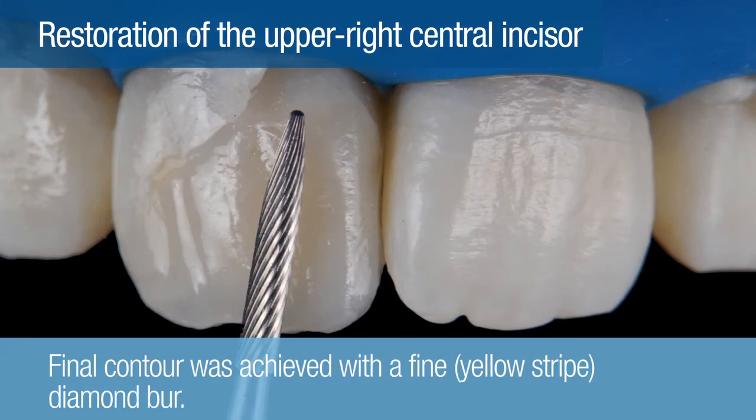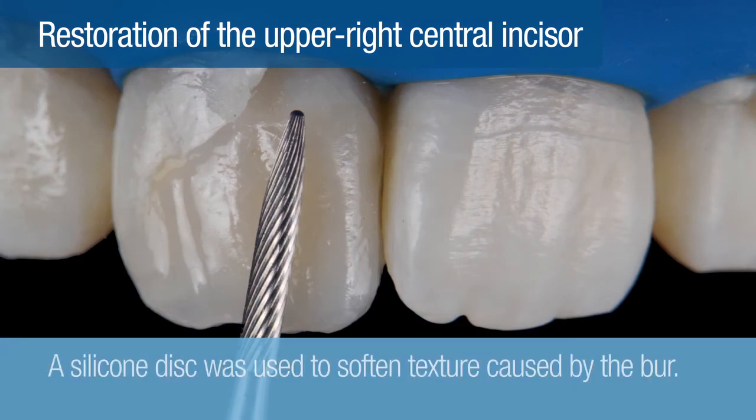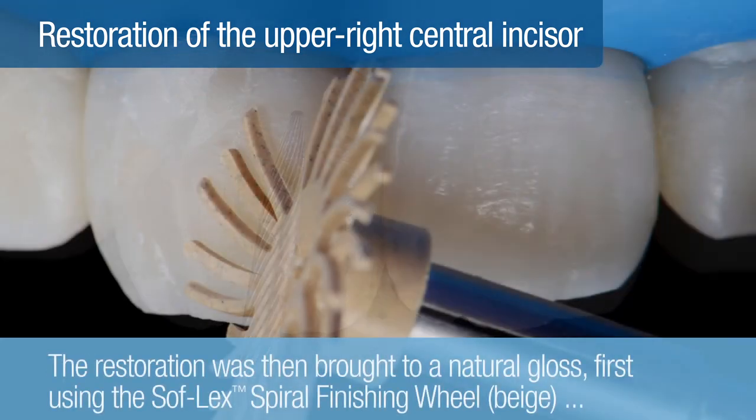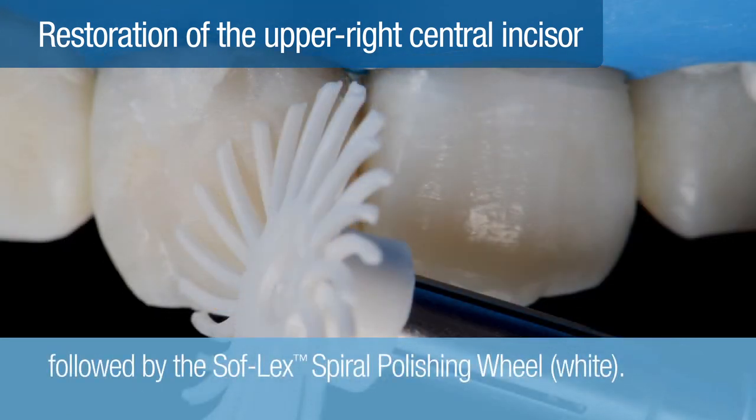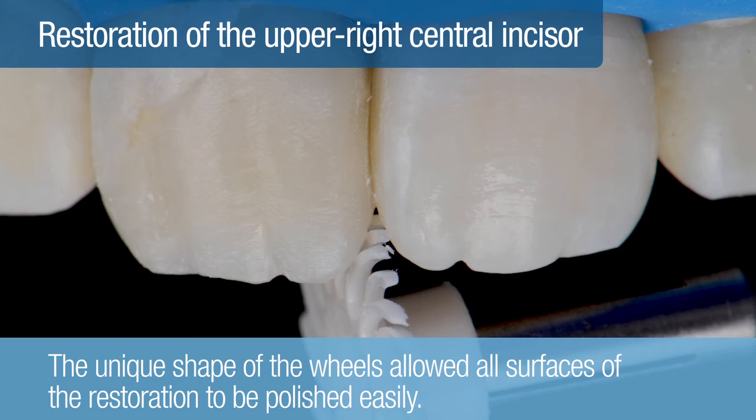Final contour was achieved with a fine yellow stripe diamond burr. A silicone disc was used to soften texture caused by the diamond burr. The restoration was then brought to a natural gloss, first using a beige Soflex spiral finishing wheel, followed by the white Soflex spiral polishing wheel. The unique shape of the wheels allowed all surfaces of the restoration to be polished easily, saving time.